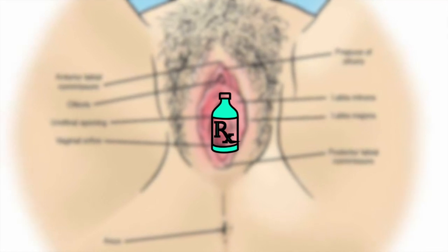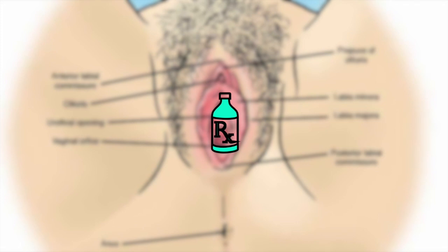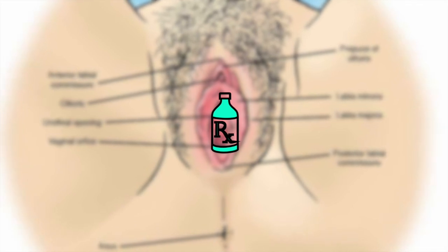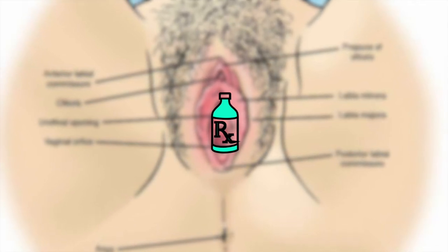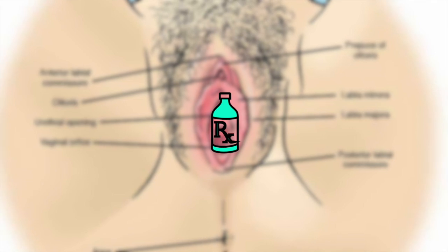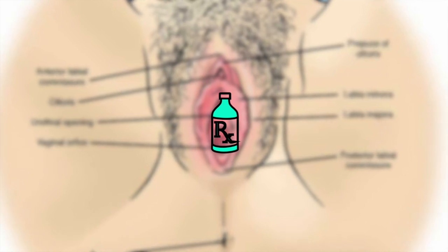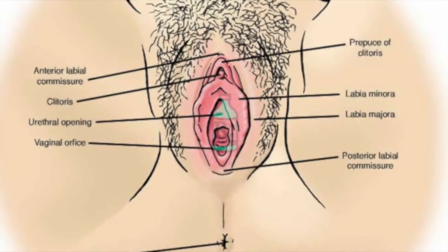Using your non-dominant hand, apply outward and lateral pressure to the labia in order to help you better visualize the meatus. This may also be achieved using a vaginal speculum.